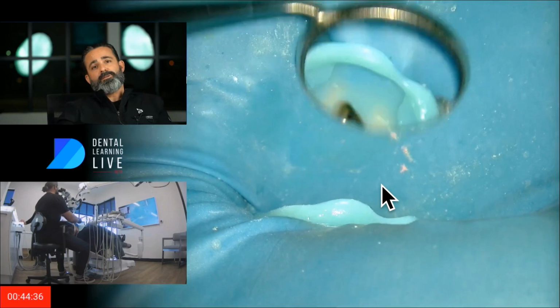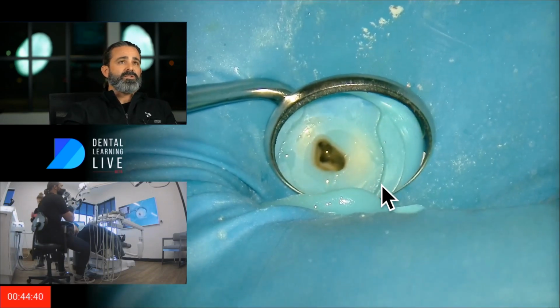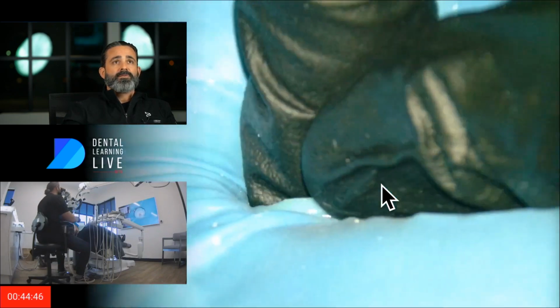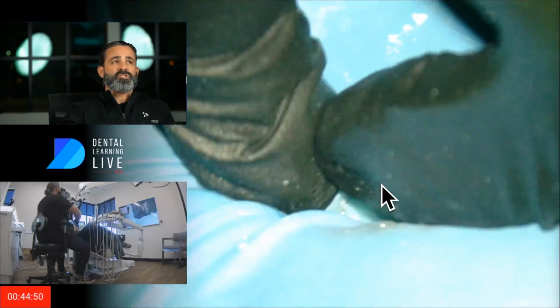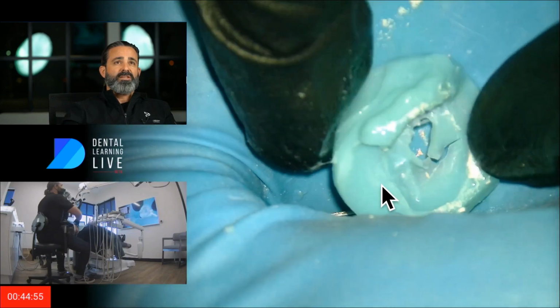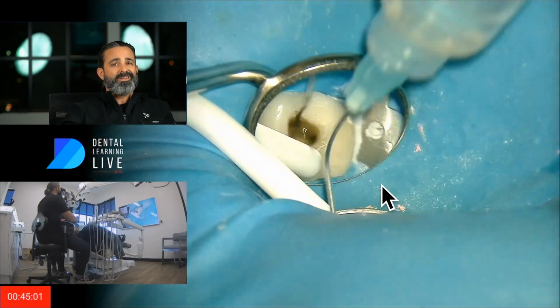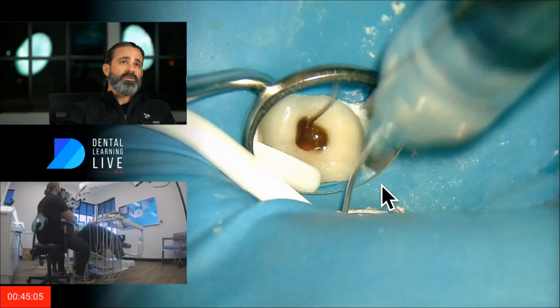Okay, so we're done, and you can see that things look intact. The sound seal did its job, and now I'm going to take this off and just show you the undercarriage here. I do that just for stability purposes, and if you have a good seal the whole time, you did a good job employing the protocols correctly.